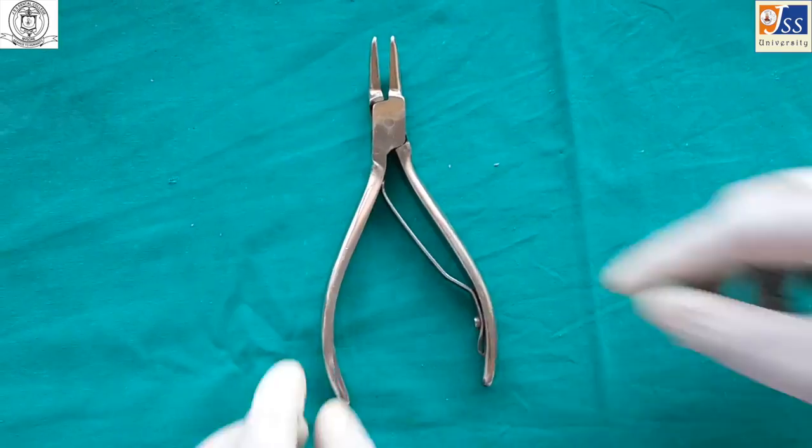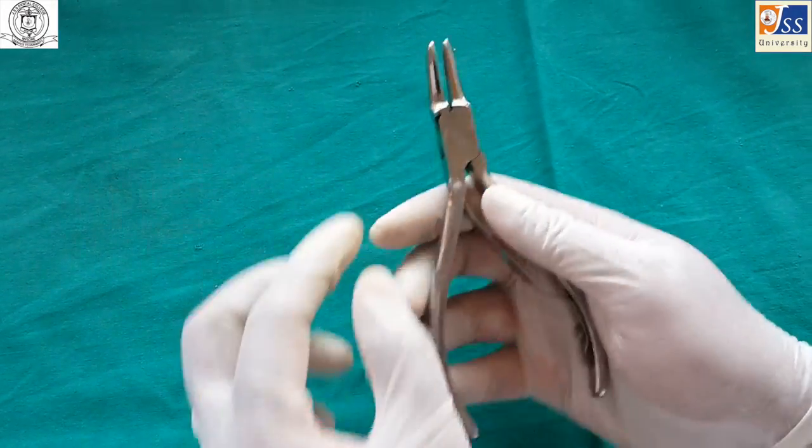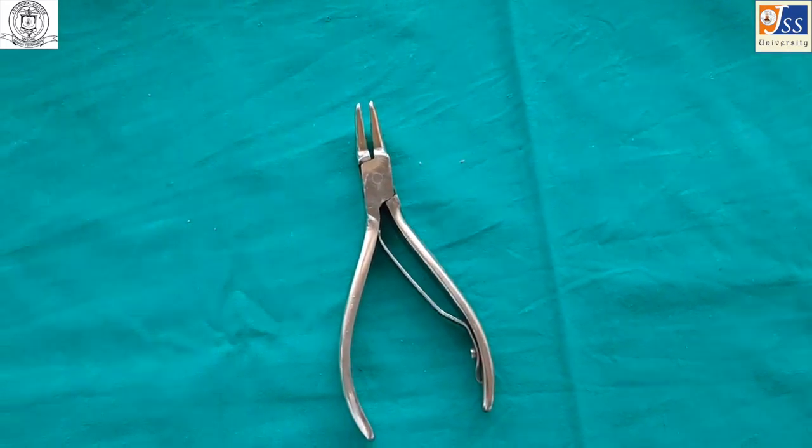The rongeur is used for removing larger or harder sharp bony projections. It comes in side-cutting and end-cutting variants and is used during extractions and alveoloplasties.